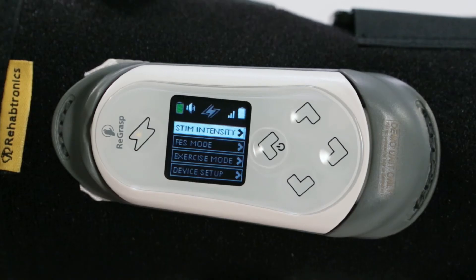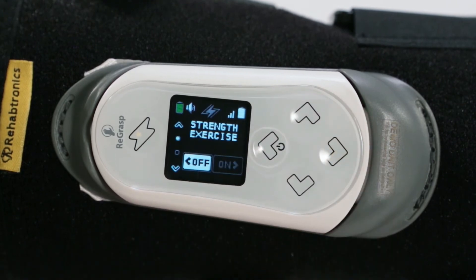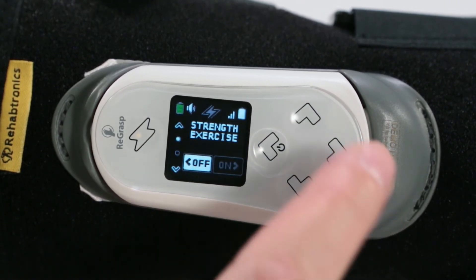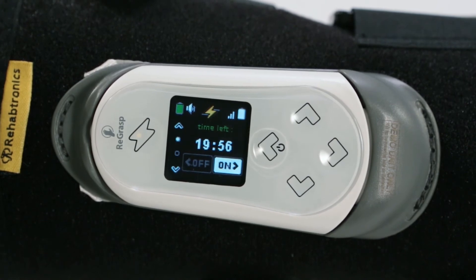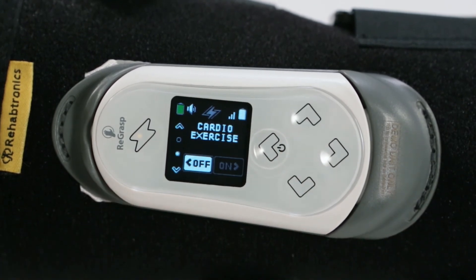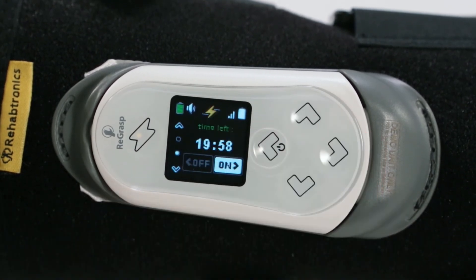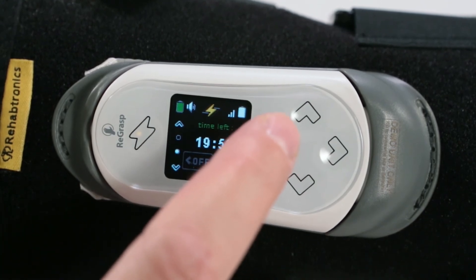To enter these modes, select Exercise mode from the main menu. To select Strength mode, select On. To select Cardio mode, scroll down once and select Cardio mode. Each mode is programmed to run for 20 minutes and can be manually stopped at any time by selecting Off.